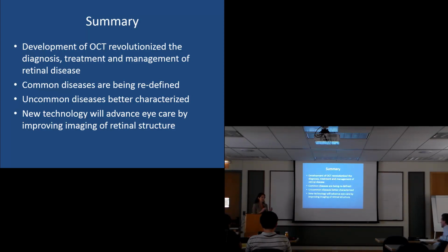However, the people in the community who are still using time domain, that's the majority, and there would be no role for it at that cost point and the expertise you have to have. Most people in day-to-day practice don't even have a dedicated photographer, so it has to be user-friendly for their staff to do as well.